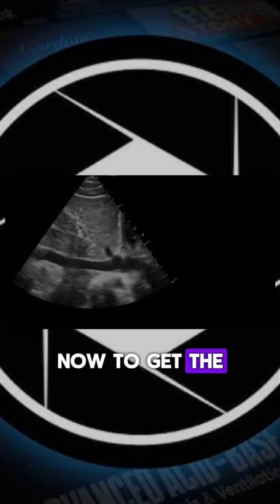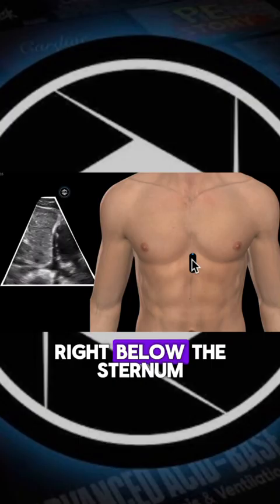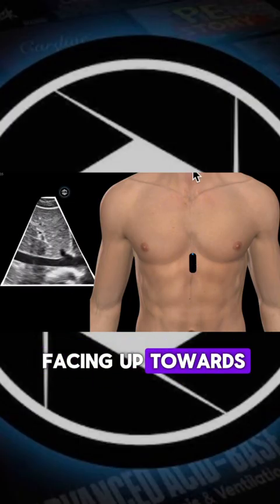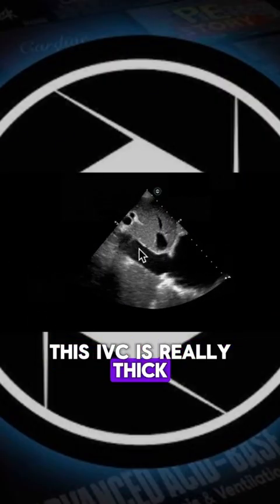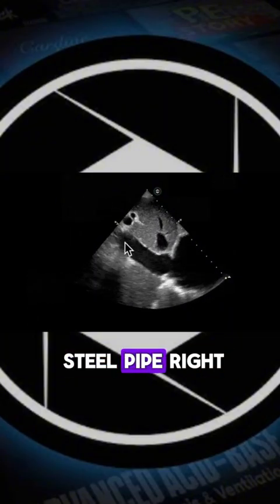Now, to get the view of the inferior vena cava, you're going to go right below the sternum, and you're going to have your probe marker facing up towards the patient's head. We can see that this IVC is really thick, and the term for this is plethoric. It looks like a steel pipe, right?